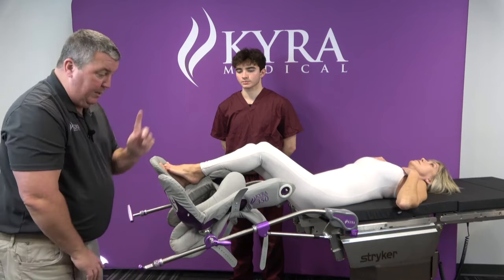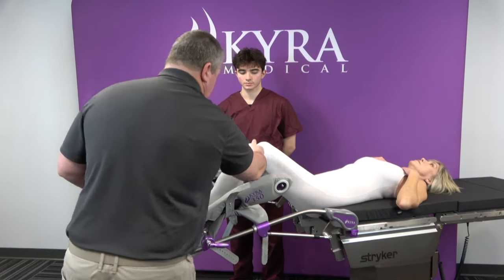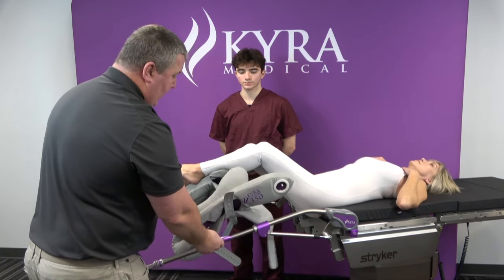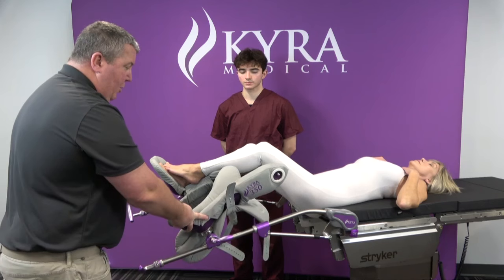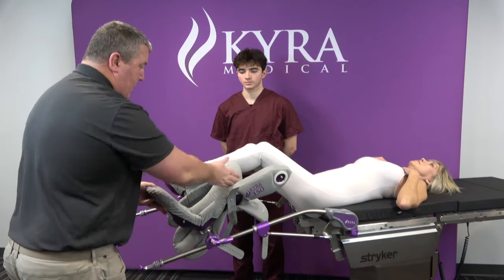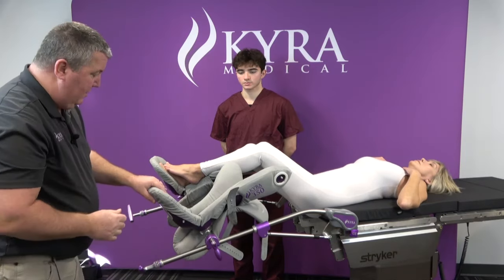Before we put the patient's leg in the system, we want to assess where the back of the patient's leg is and match that up to the back of the stirrup — not the fin part, but where the calf sits. I want to get that alignment done. Then at the very end, I turn the boot across so that I'm imagining a line that goes from toe to knee to the opposite shoulder — TKO. Once I have that, I tighten this down and securely tighten it to the spar.